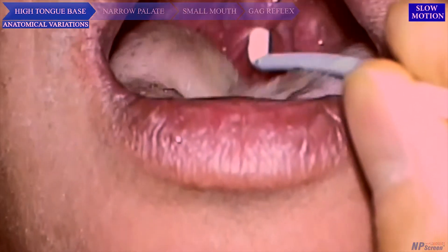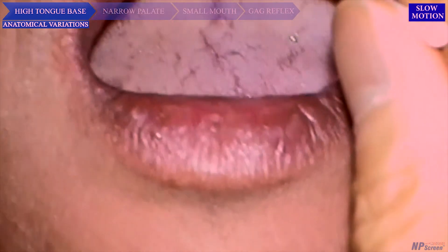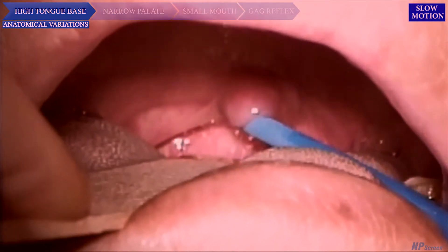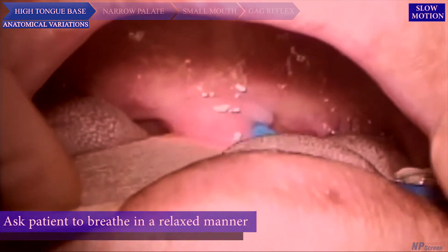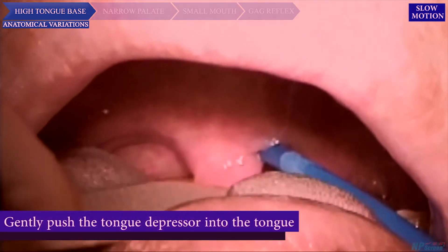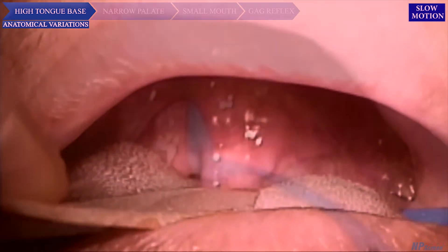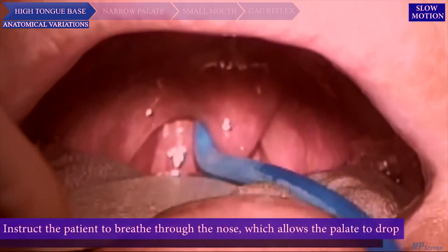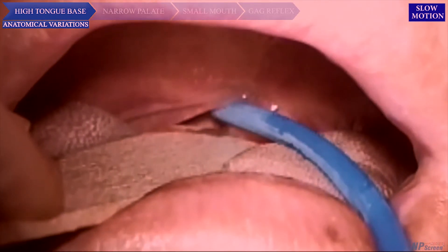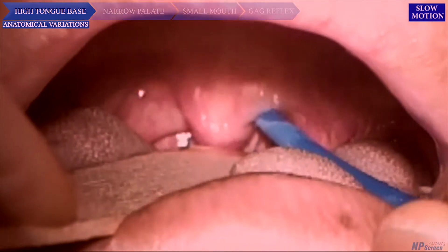High tongue base: Sometimes you cannot see the back wall of the oropharynx because of a high tongue base. In this situation, ask the patient to breathe in a relaxed manner, then gently push the tongue down with a tongue depressor and insert it further to better expose the oropharynx. Instruct the patient to breathe through the nose, which will allow the soft palate to drop and increase the space between the nasopharyngeal wall and the soft palate, making insertion of the brush easier.